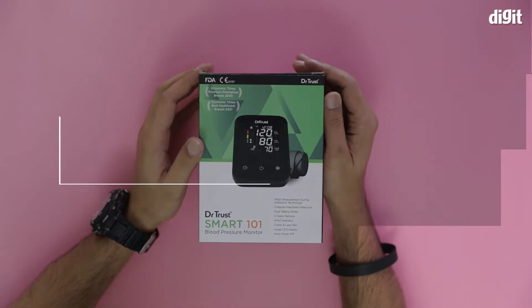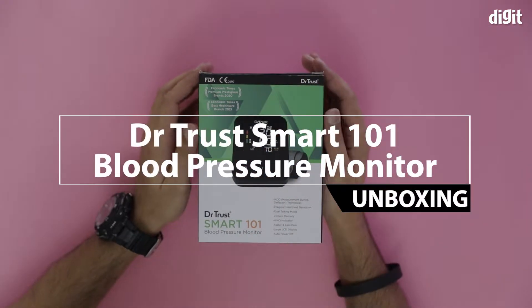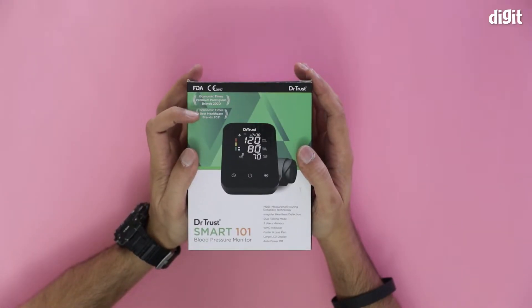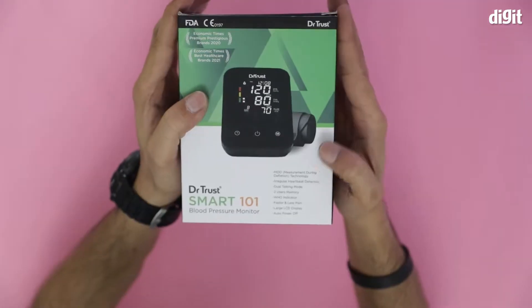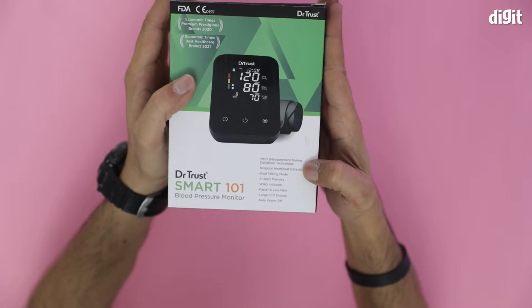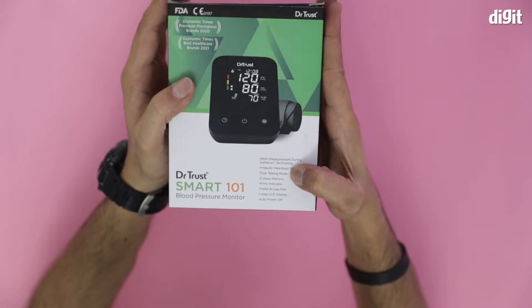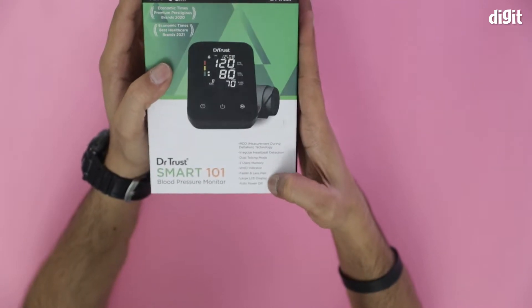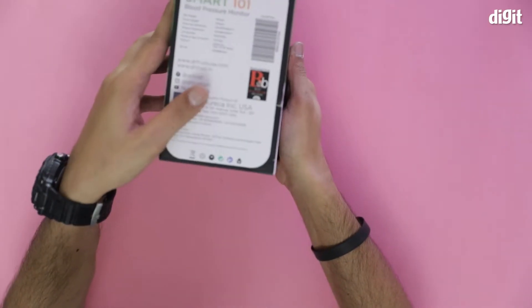Hi, in this video we're going to unbox the Dr. Trust Smart 101 Blood Pressure Monitor. This has a lot of information on top. This is an award-winning blood pressure monitor. It has MDD technology which is measurement during deflation, which is kind of important. It detects irregular heartbeat and has dual talking mode. Also has two users memory, large LCD display and auto power off. That's all the information on the box.